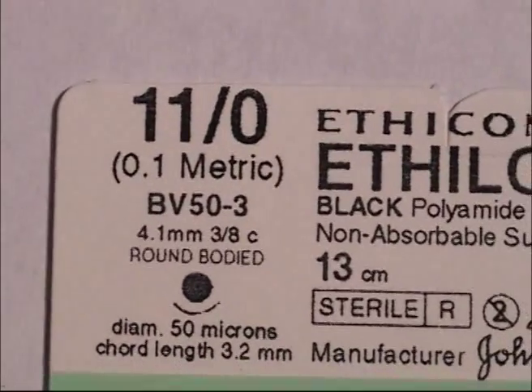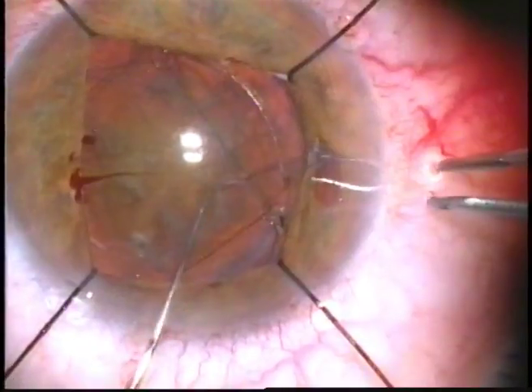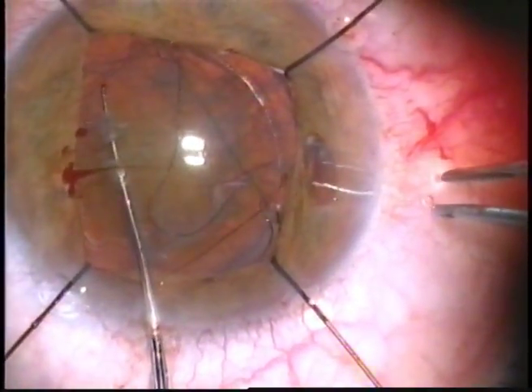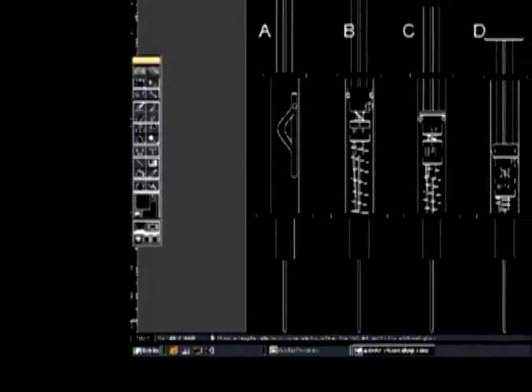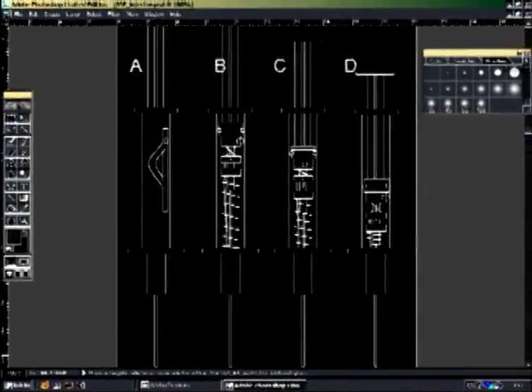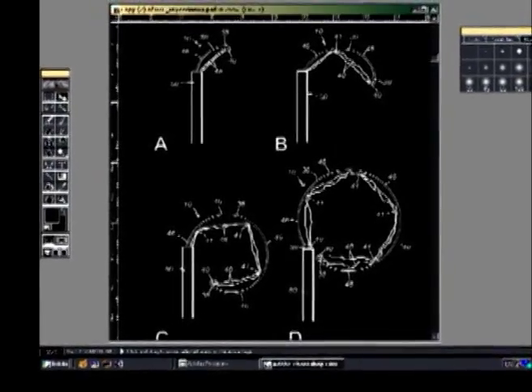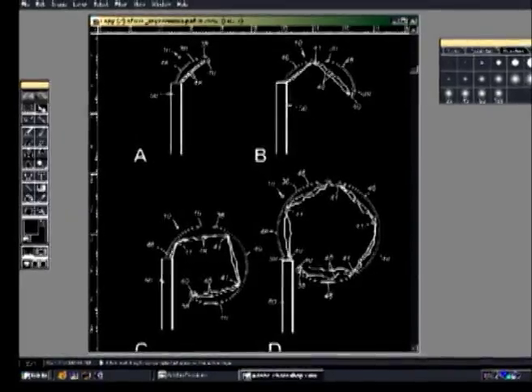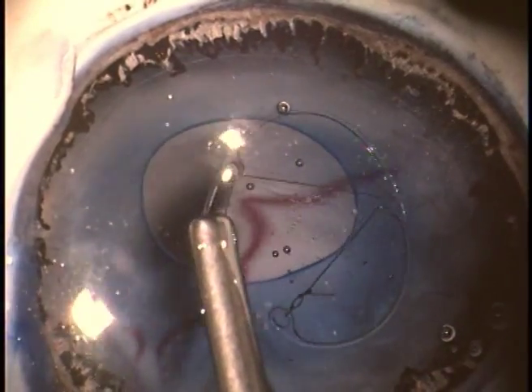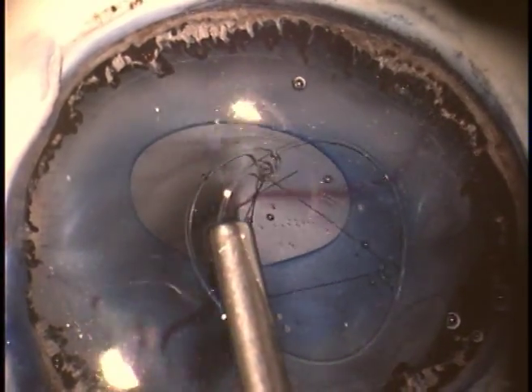An 11-0 nylon suture has been used as the tensing cord material to facilitate cord removal by pulling from one end. Alternatively, a custom designed endocapsular tension ring inserter can be used. This inserter must be designed to exert a variable calculated tension over the tensing cord during plunger travel, so the ring can be delivered within the capsular bag in a reduced diameter and then allowed to expand.